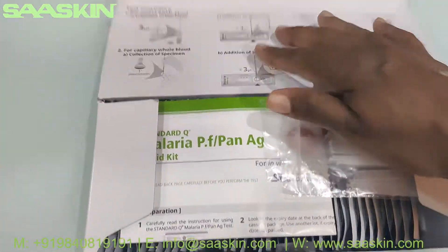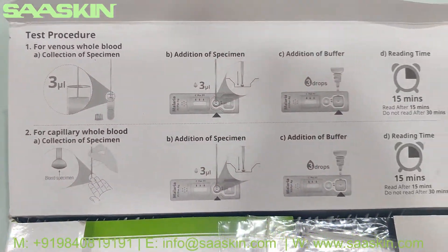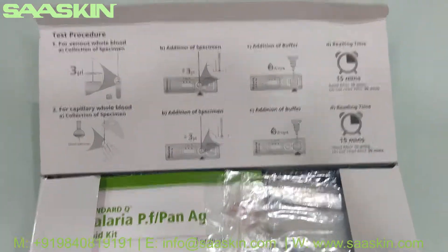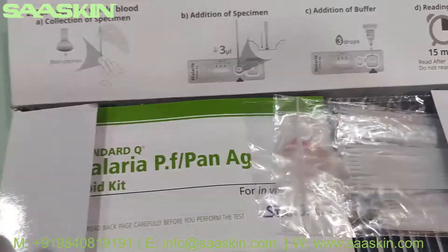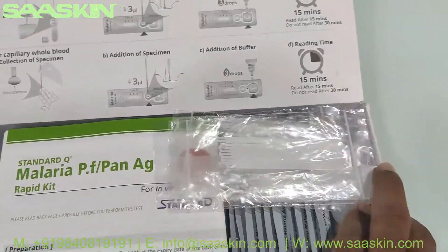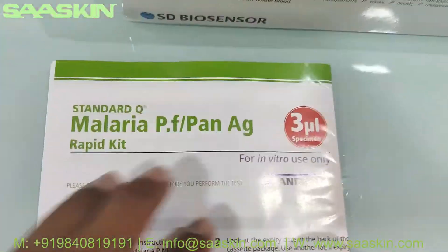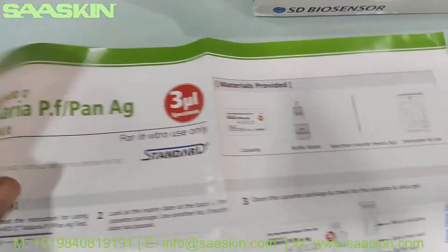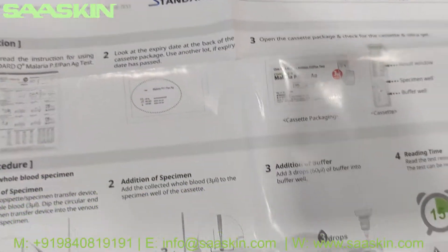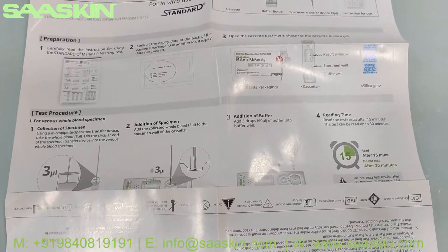This is how the box inside looks like. You can see the test procedure is also given in the box. Inside you get an instruction manual — this is like an IFU brochure which has the complete product details and also the instructions on how to use it, how to prepare your samples, and the complete test procedure.